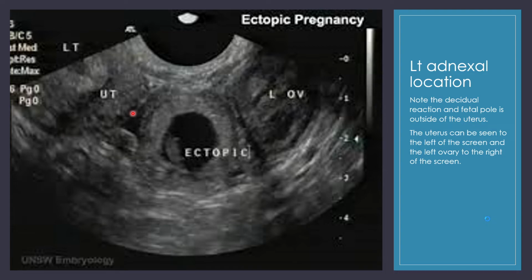However, if you have a patient that comes in and you have a positive pregnancy test, so these are the things that you need to kind of key in that there may be an ectopic. Okay, number 1, positive pregnancy test. Number 2, empty uterus. So there's no gestational sac in the uterus. Number 3, you see an adnexal mass.